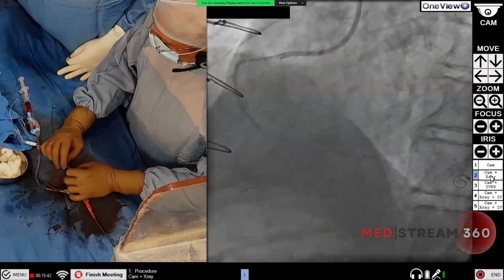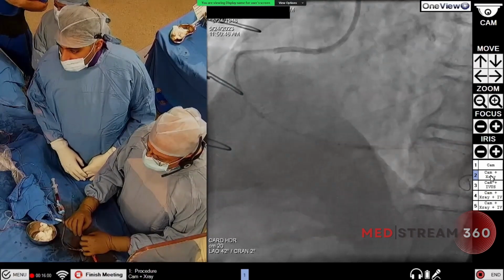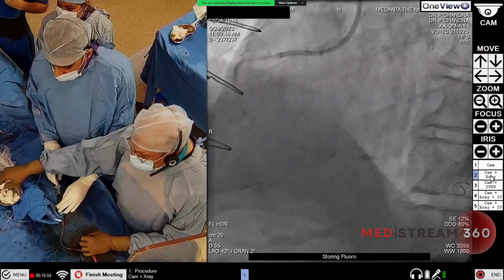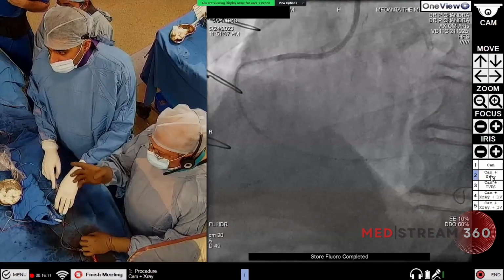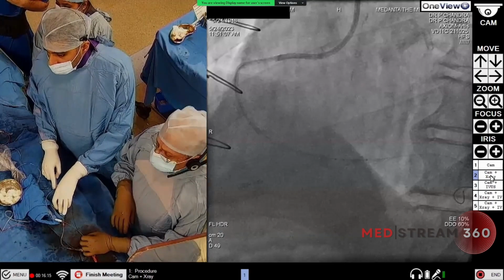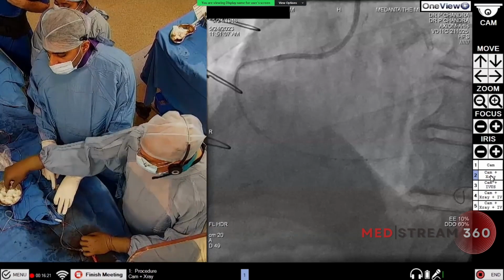Okay. One more. So typically, in this kind of situation, I think most of you will agree that in a calcified lesion like this, the most appropriate therapy will be IVL because of few reasons. One, that it is quite distal. Taking a rota all the way through this tortuous segment may be difficult. The second is that the vessel size is very big. So even if we use a 1.5 rota, it won't make much difference.